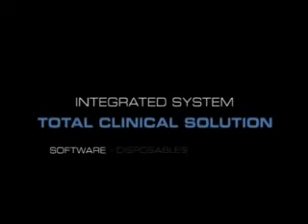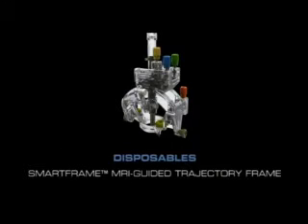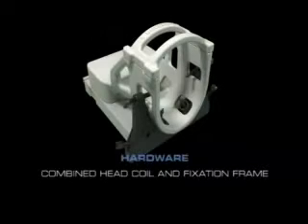ClearPoint is an integrated system of software, disposable components, and reusable hardware. The software runs on the ClearPoint workstation and is used for the planning, targeting, and delivery of the neurological intervention. The disposable components are built around the smart frame trajectory guide. The reusable hardware components include the head coil and integrated head fixation frame.